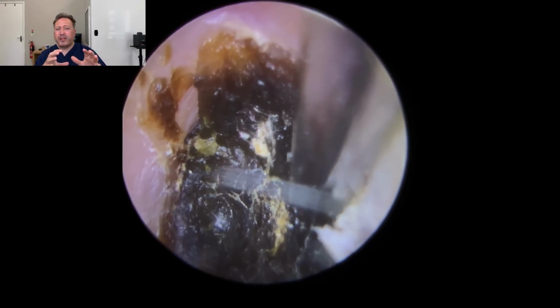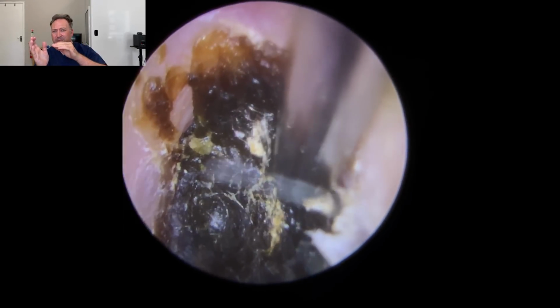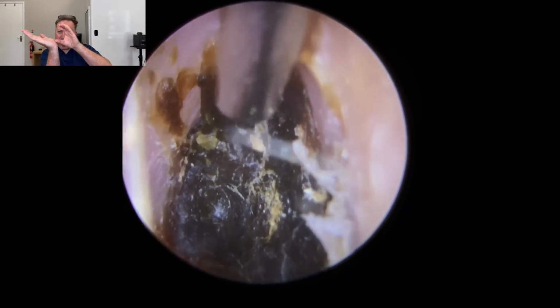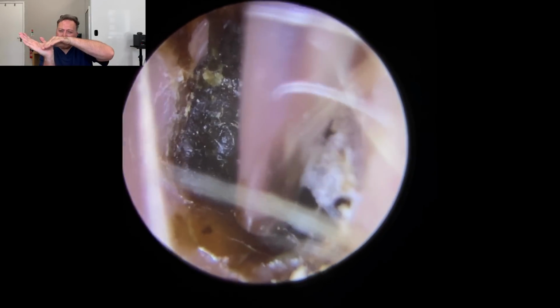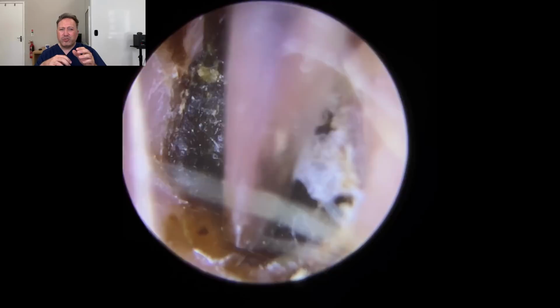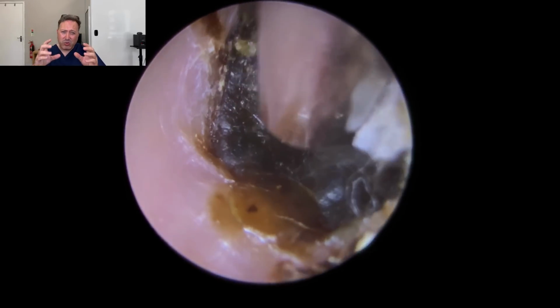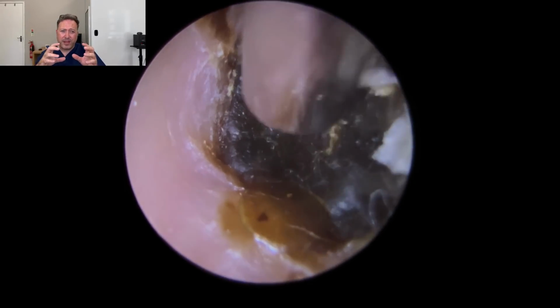So I'm using the fine end here, trying to stay just above the skin. So imagine this is the end of the fine end here, just working very, very slowly across the edge, just trying to lift on the edge there and lift any pieces up like this. There's a lot of dry skin in here and I'm probing all around the outside edge to try and find a weak spot, but it's just so firmly hardened up in there.